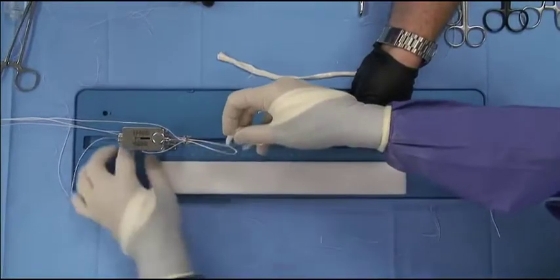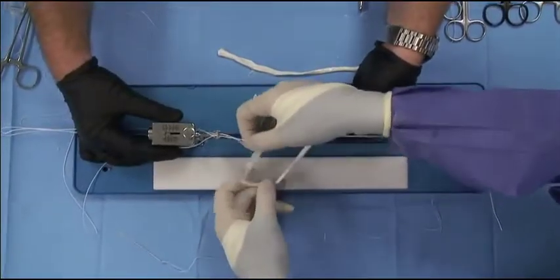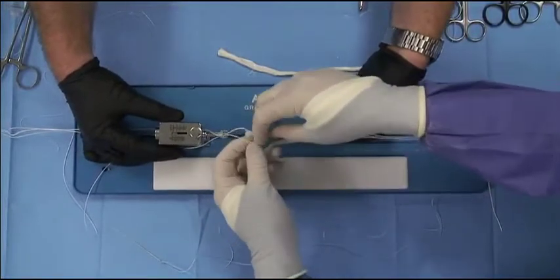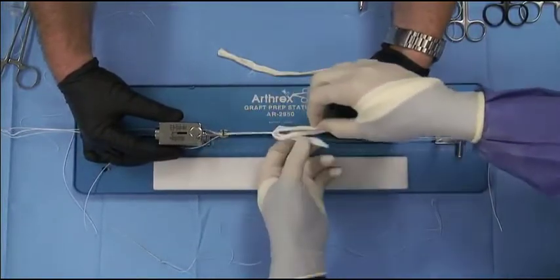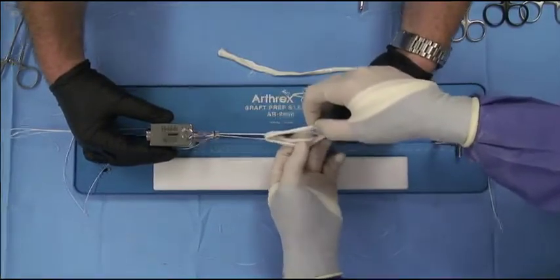And now I'm going to pass it on the femoral side, and we bring one limb in one direction and the other limb in the other direction, so that now you see I'm going to have a shorter and quadrupled graft. And you can see how it's coming through.